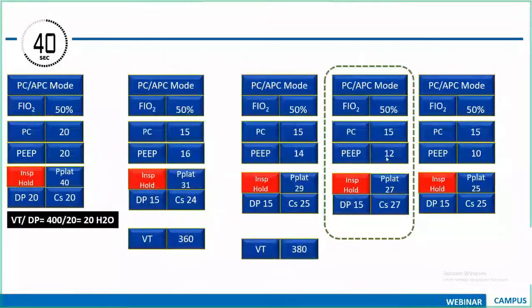I've already told you there are many methods for PEEP titration. This is one simple bedside method by which you can titrate PEEP for ARDS. Okay, as I've already told, this is only 3 sessions. We have so many topics to cover. So at least if you understand this basic concept, you can ventilate a severe ARDS patient. So I think that concept is very, very clear.